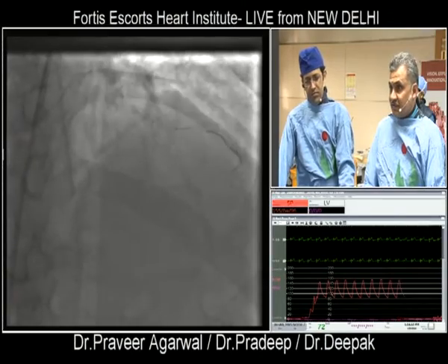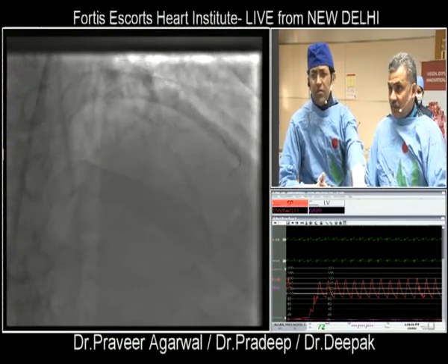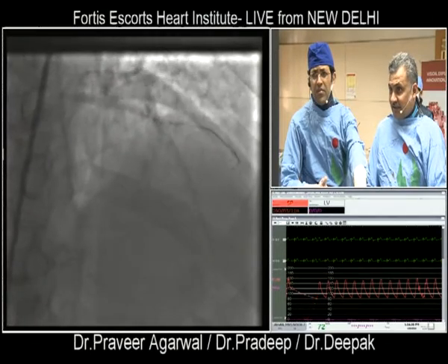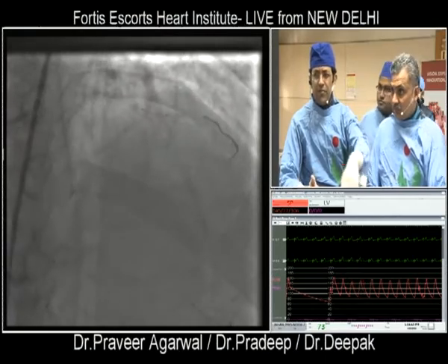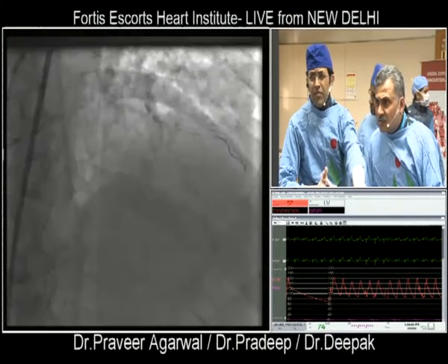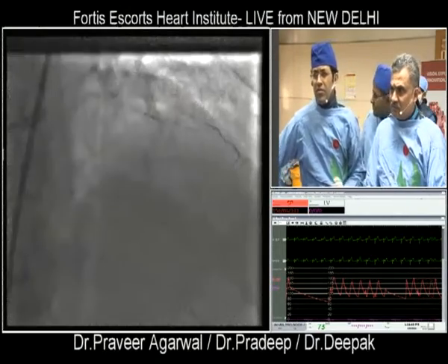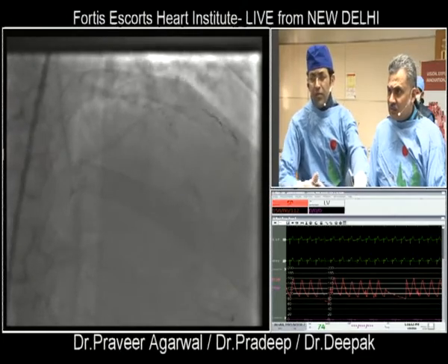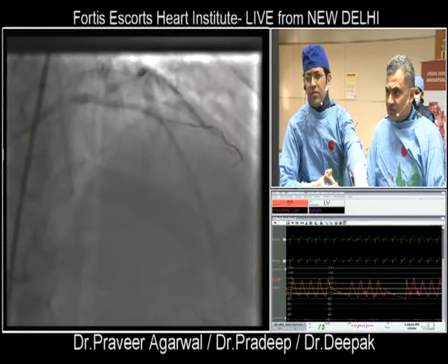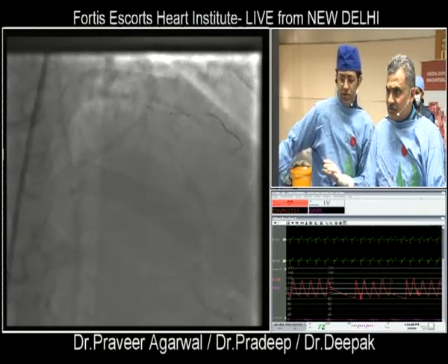Check. What is your plan? Let me just tell you the diagonal, then I'll let you know. I'll be just at the ostium in the dilated segment.